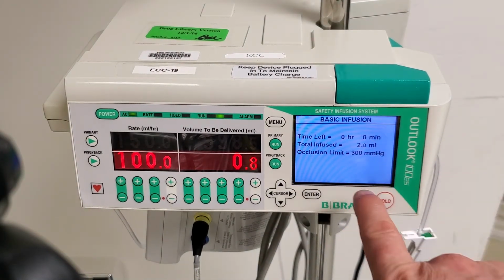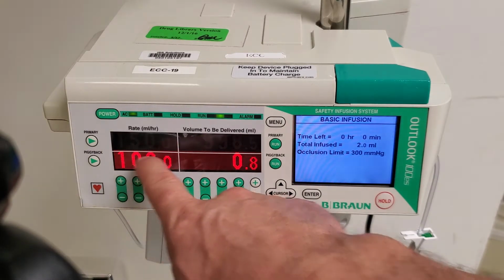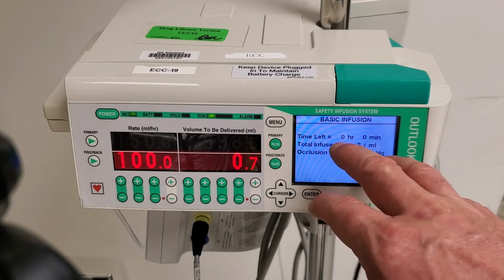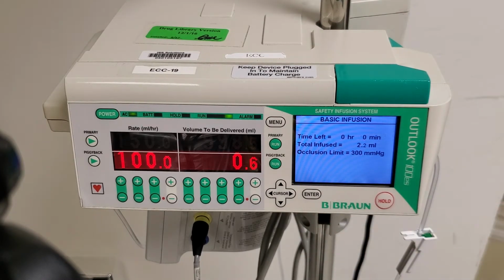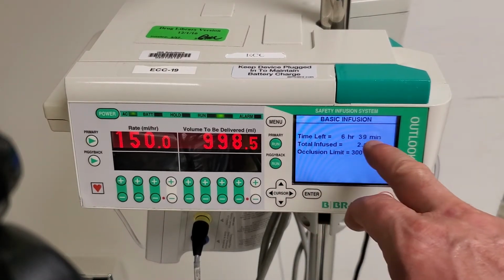So now there's 0 minutes remaining on the secondary infusion. So this should end any second. And then the pump reverts back to the primary infusion, and your time left is updated.